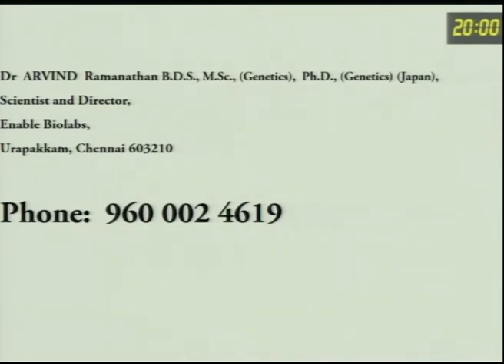Right now, I'm doing the cell-free DNA component and the torque teno virus test. All these I don't charge for right now because I want to have a database of at least 25 to 50 samples matched with biopsy reports before going into the commercial aspect. I have received at least 25 samples from the global team, and since the test is really free, if some of you are interested, you can contact me. The blood sample has to be collected in a specialized tube called PAXgene tubes. The cost of one tube is 1,200 rupees, but you can transport the blood at room temperature.